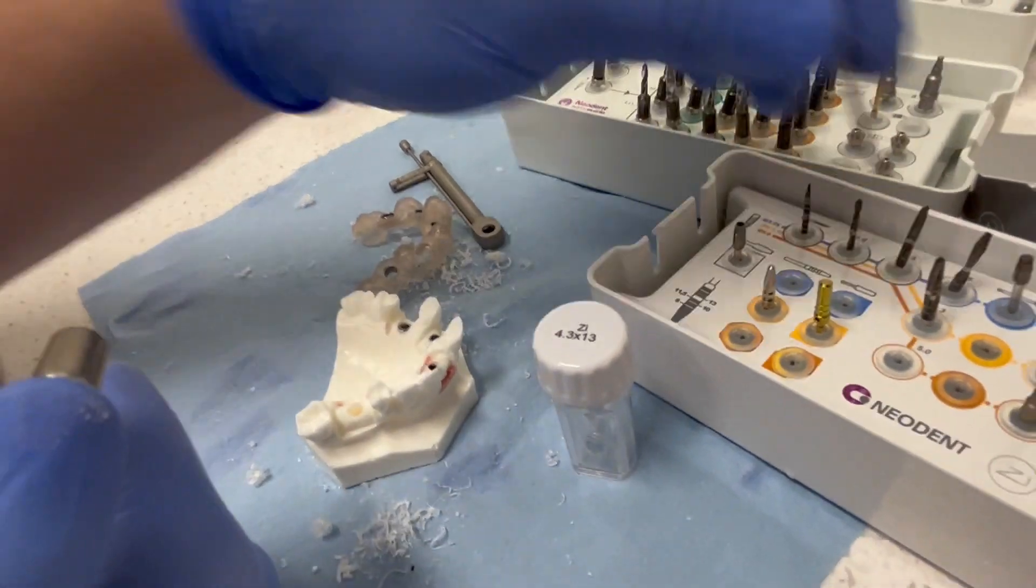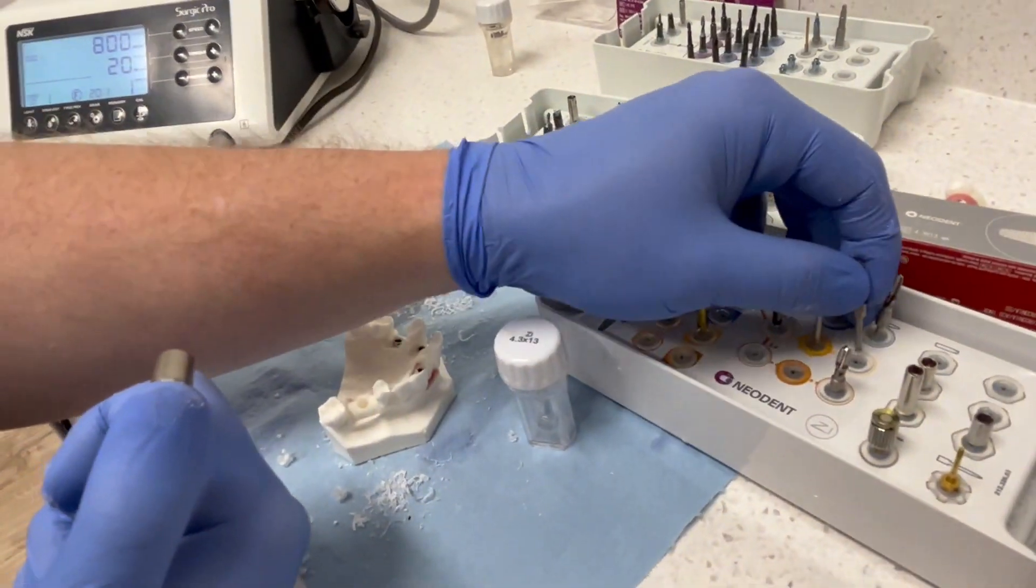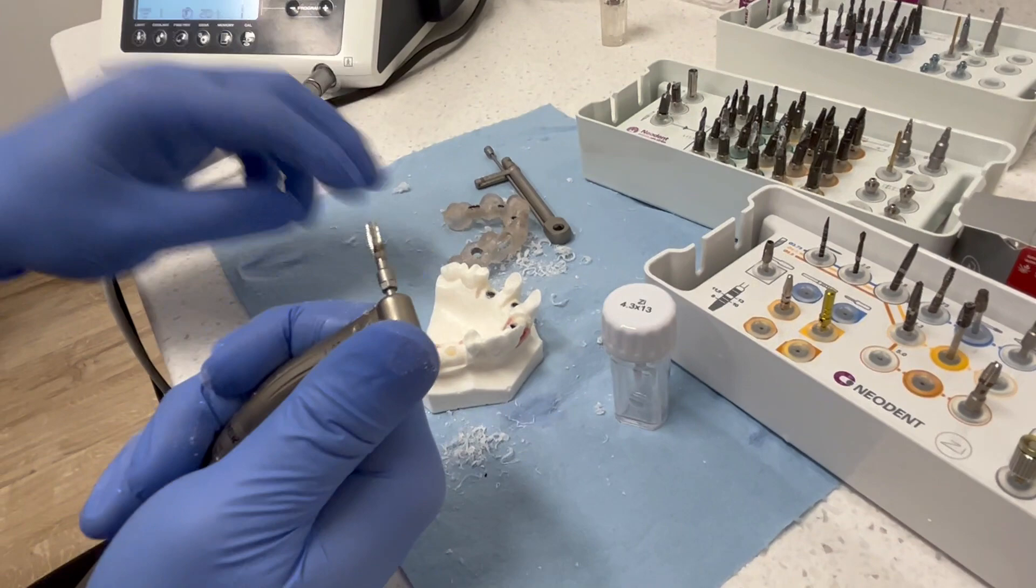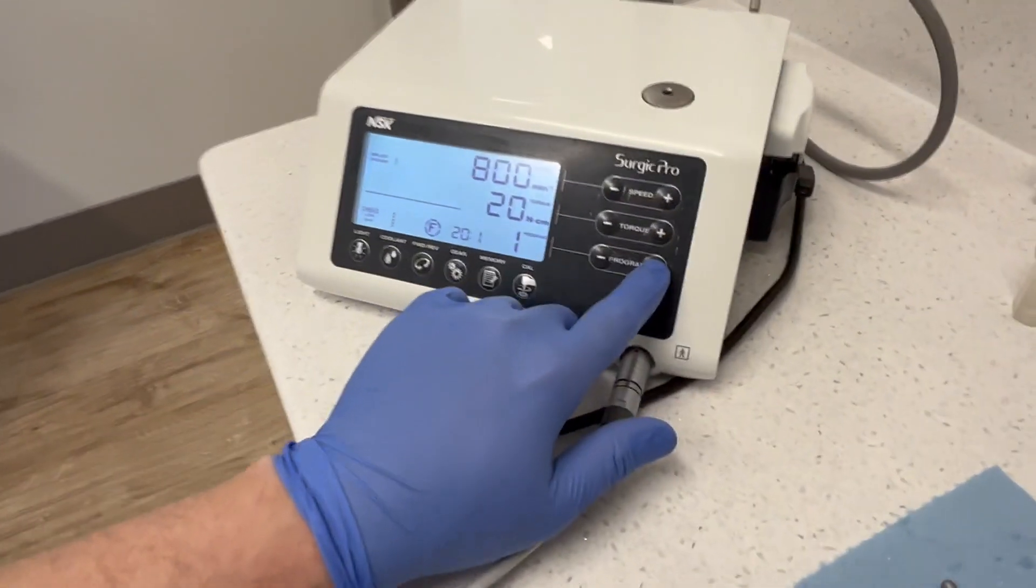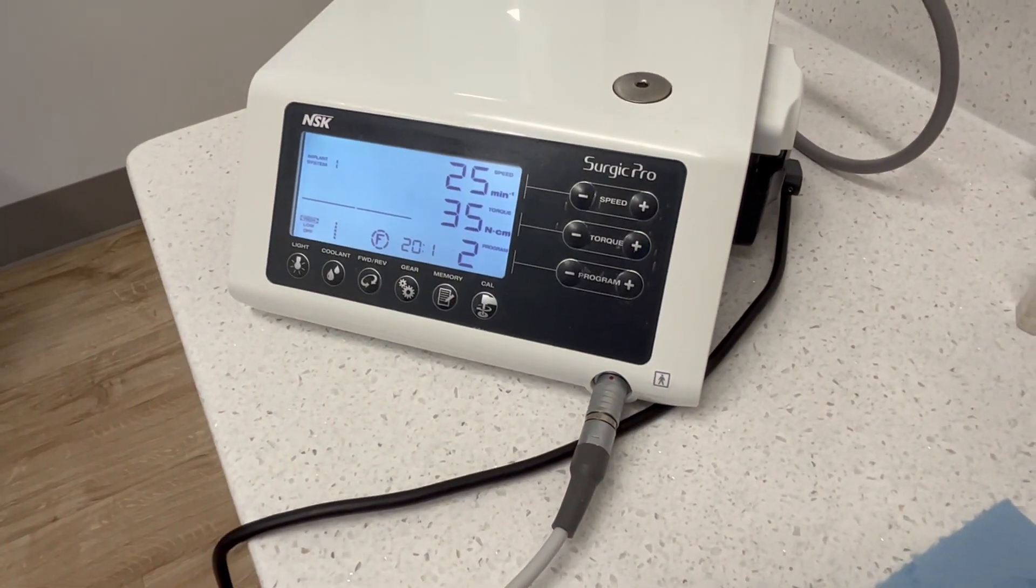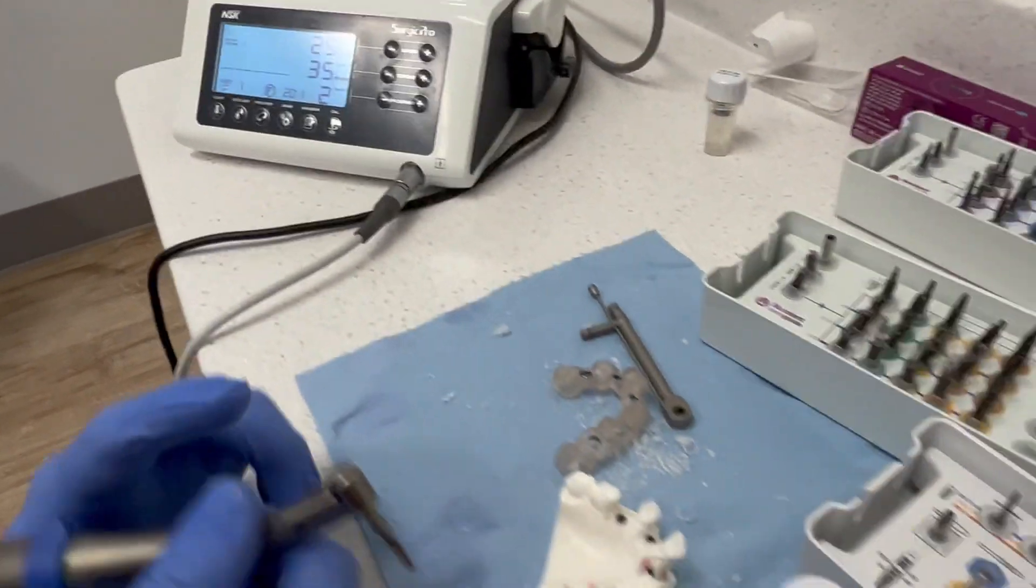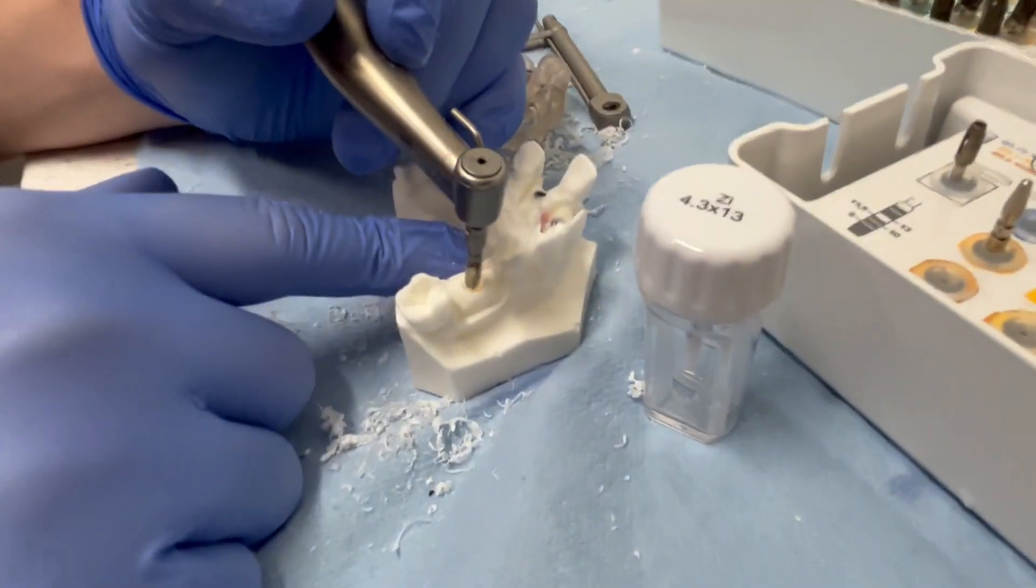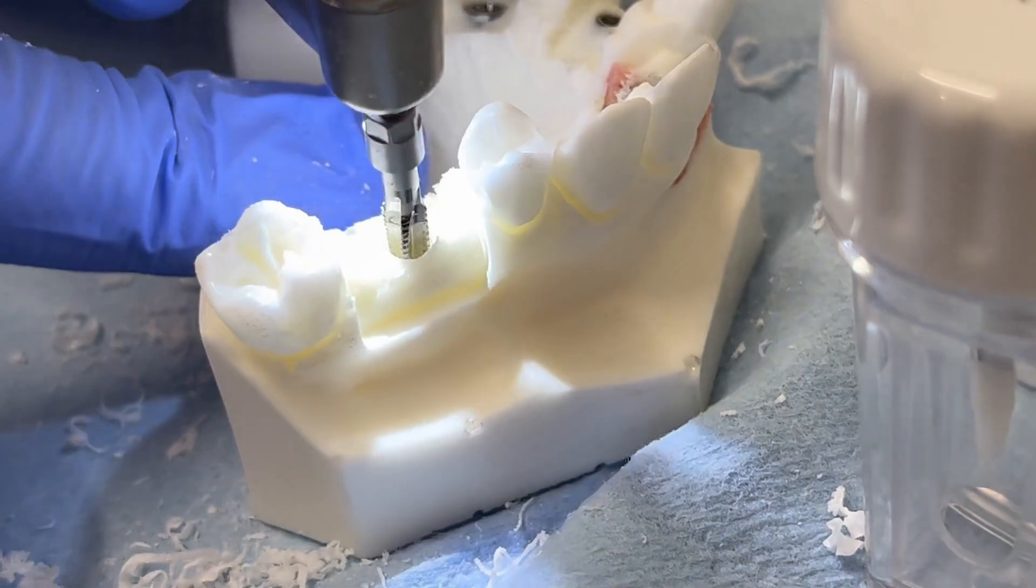Now the big thing is we're going to thread the inside of this osteotomy just like we would with our thread pitch on our implant. So here we want to take this down to 25 RPMs. And we're going to let this kind of guide its own path down to depth to thread this implant osteotomy.